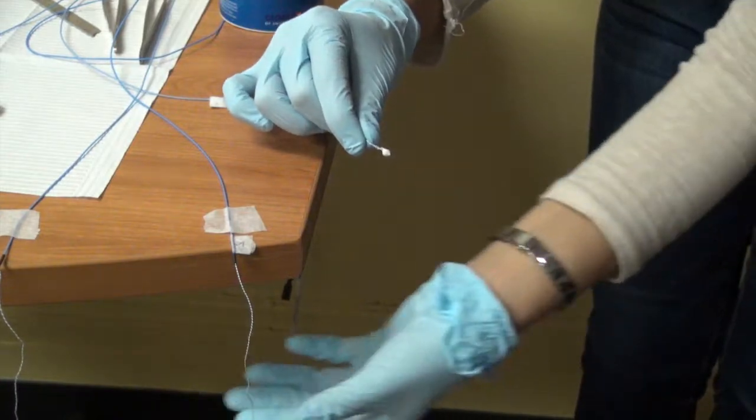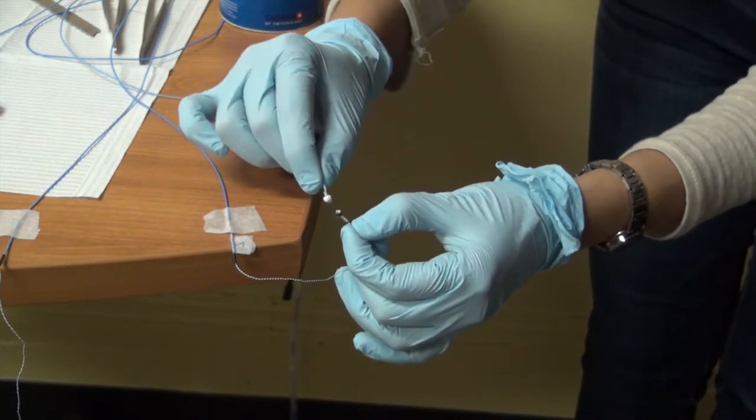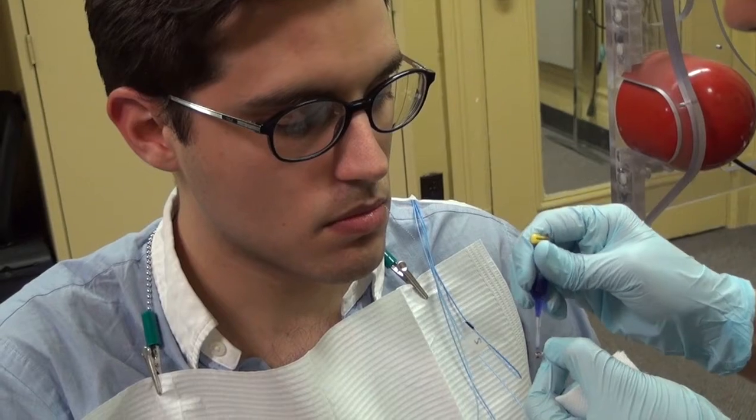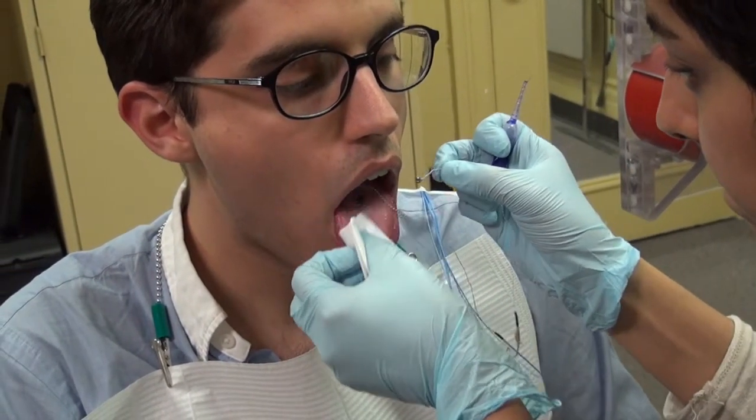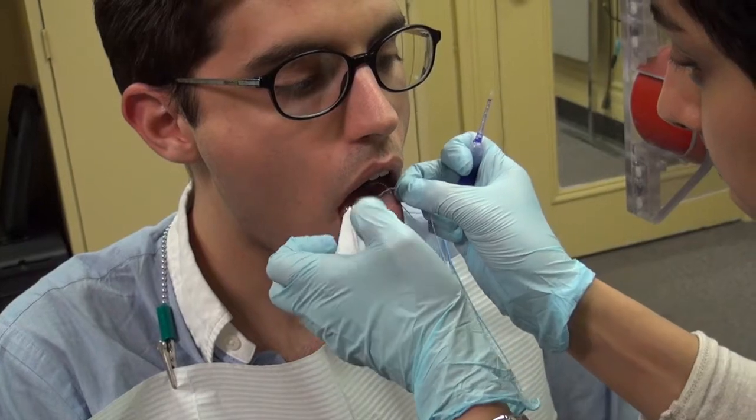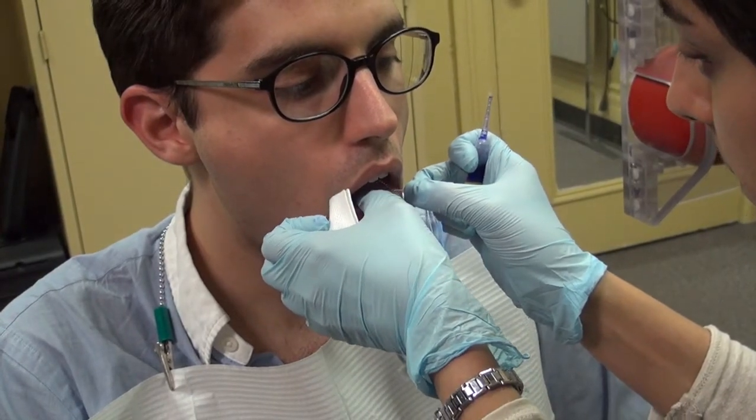Disinfected coils are coated with latex. After the latex coat hardens, the coils are temporarily glued to the participant's articulators with a non-toxic dental adhesive.